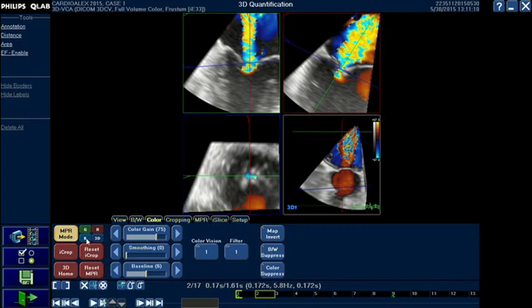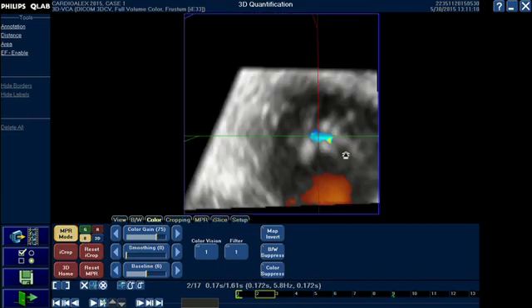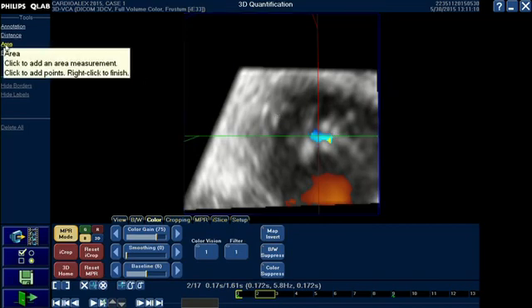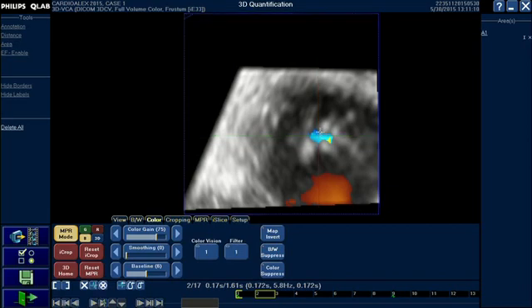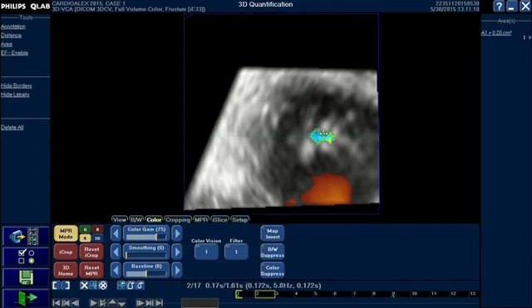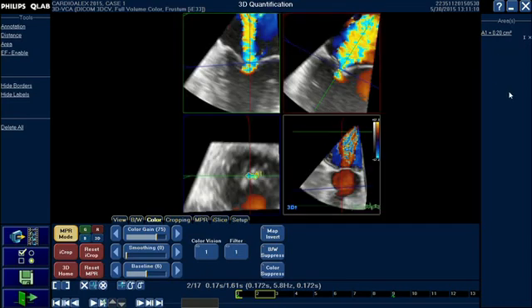From here you can enlarge the blue frame by clicking the blue box button. Here we have the regurgitant orifice clearly visible. What remains is to trace it by left-clicking around the border of the orifice, point by point. The last click must be a right-click in order to complete the measurement of the vena contracta area. This gives us a result of 0.2 centimeters squared. I hope that was of value — thank you so much.